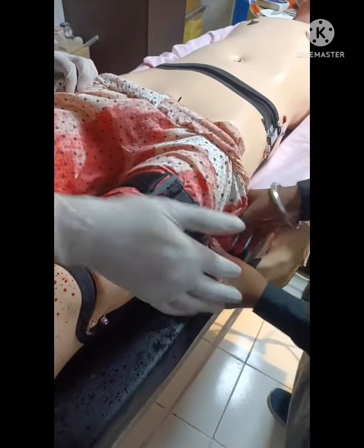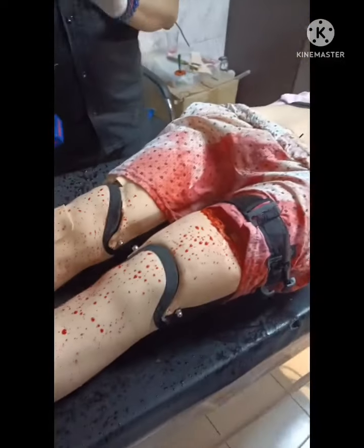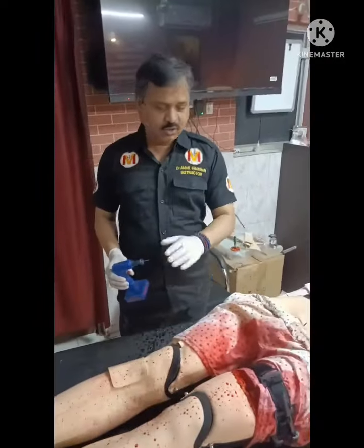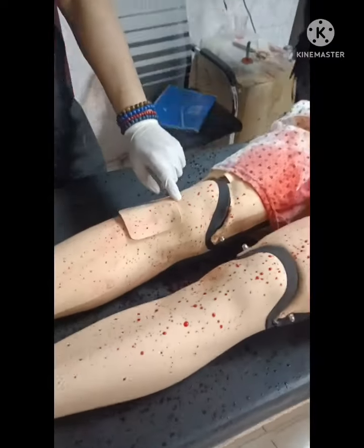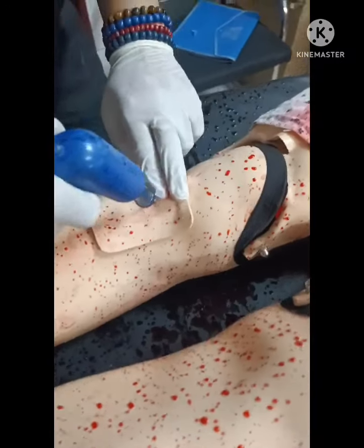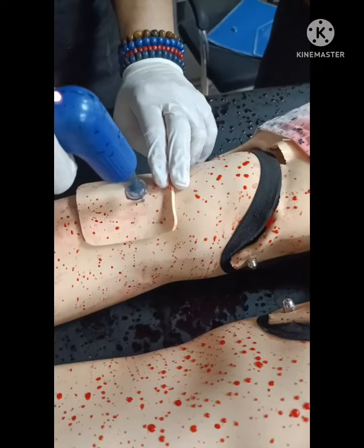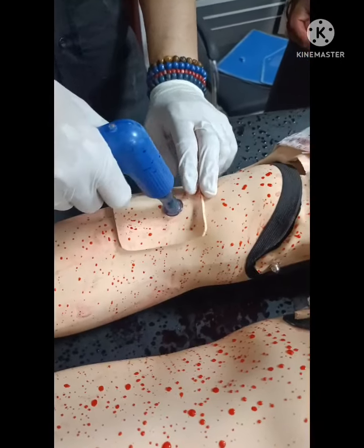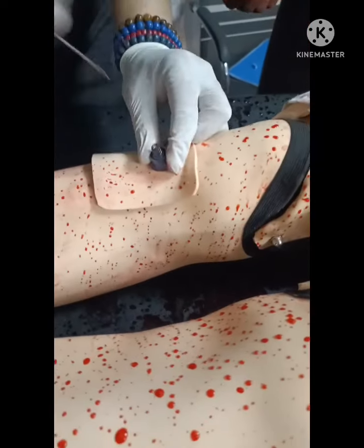You fit the windlass in the column. Now if you want to run a scenario where the patient is in shock and there is no peripheral vein available, then you go for IO access. We have given IO access also. Locate the tibial tuberosity, and then go 1 to 2 centimeters, or 1 to 2 fingers. You get a giveaway feeling, and then you aspirate.